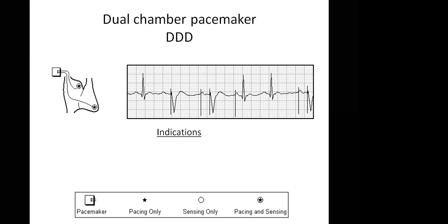Yes, madam. This is Dr. Julius. Dr. Julius, yes. How do we see the third letter? How do we appreciate triggered activity with an ECG like this? Okay, good. Don't worry yourself. As I said, technically, triggered activity is an unnecessary word when you see it with EP. It's not a necessary word. In fact, you won't even see it in the coding. And I'll tell you why.